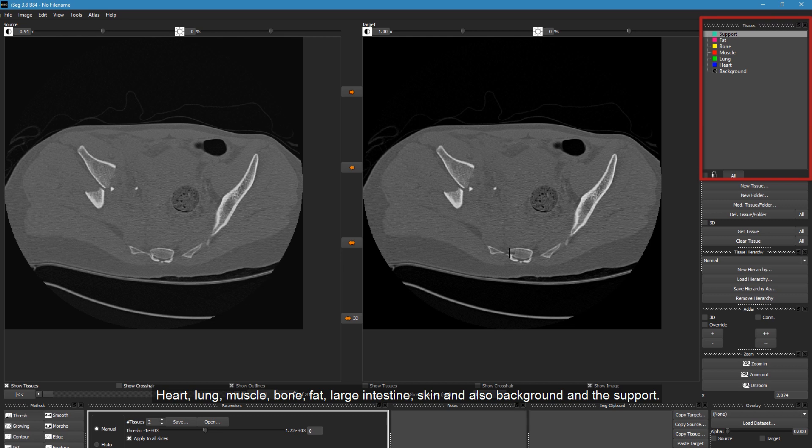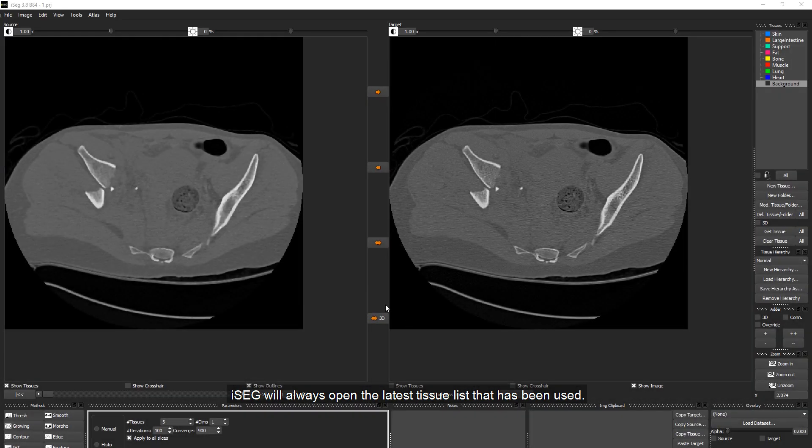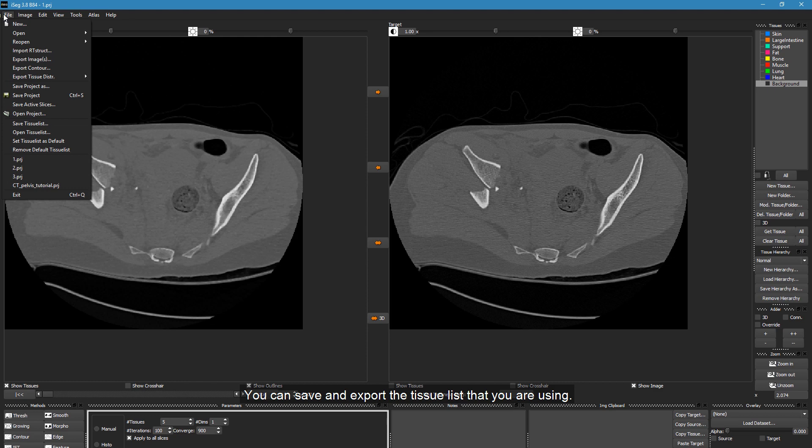We will need the following tissues for this tutorial: Heart, Lung, Muscle, Bone, Fat, Large Intestine, Skin, and also Background and Support. iSEG will always open the latest tissue list that has been used. You can save and export the tissue list that you are using.